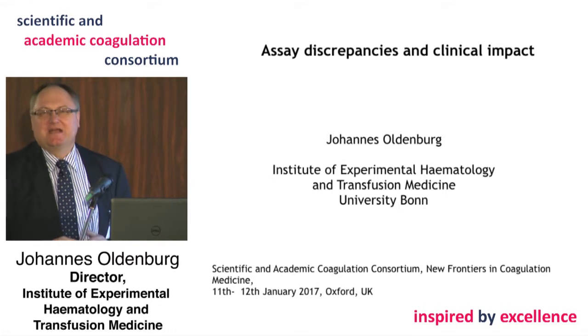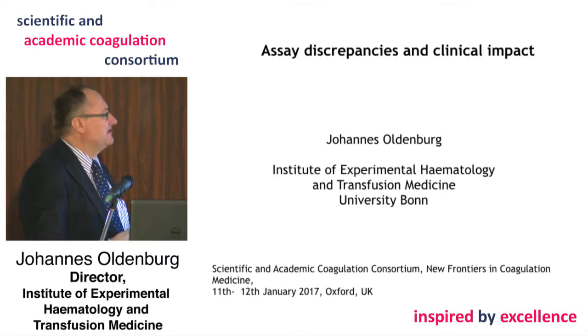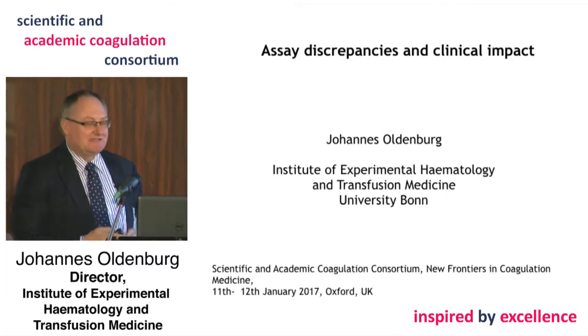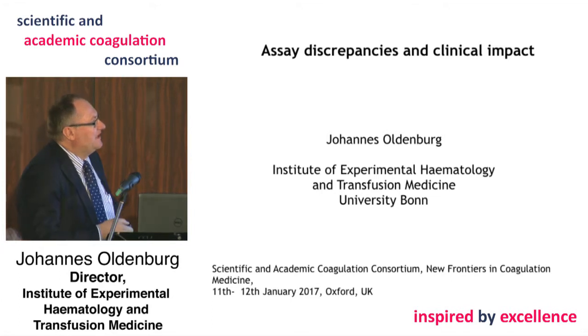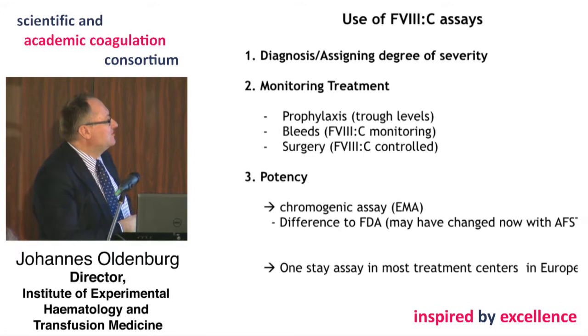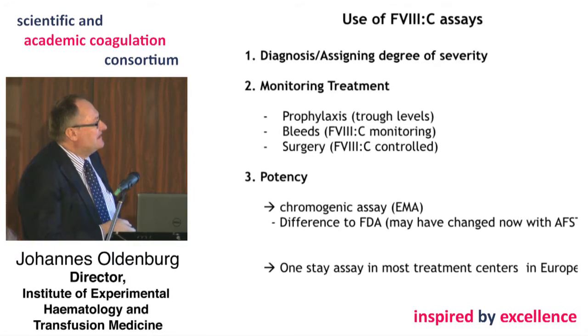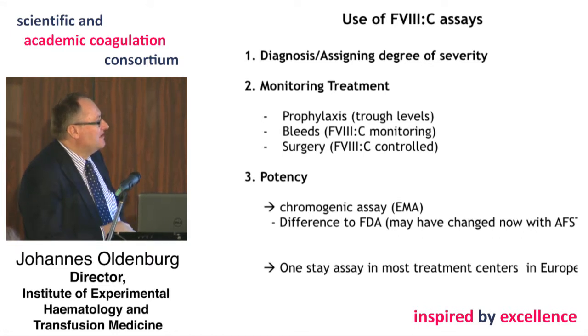I was asked by the organizers to speak about factor VIII assay discrepancies and clinical impact. So we are using these assays for assigning the patient a diagnosis. We are using these assays for monitoring treatment, for either prophylaxis, bleeds, or surgery.